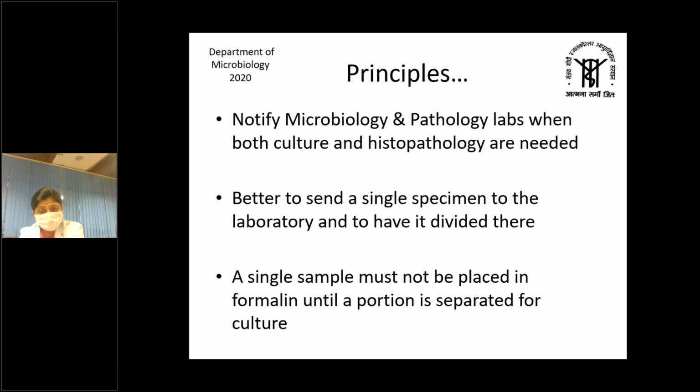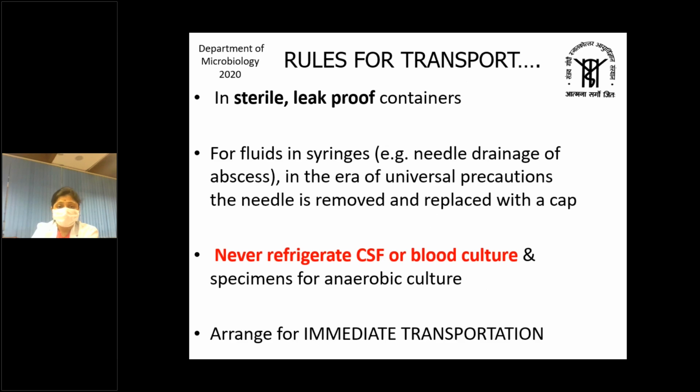Or if you are dividing it at the site of sample collection, for example, if it is an intraoperative specimen being done in the OT itself, then please remember to divide one sample for culture in saline and the other sample for formalin in histopathology testing. So a single sample completely should not be placed in formalin at all. What are the other basic rules that have to be followed? It should be in a sterile leak-proof container.